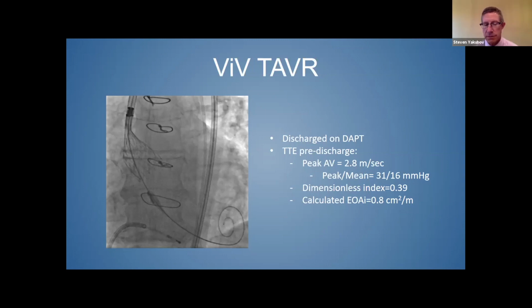I'll just say that what I typically do is I go 1 millimeter more than the inner diameter of the valve, at least. And I typically use a true balloon. Guy, also for you, true balloon? Yes, true balloon.